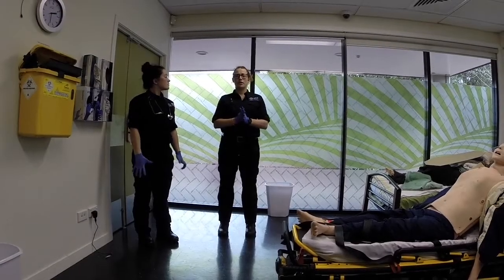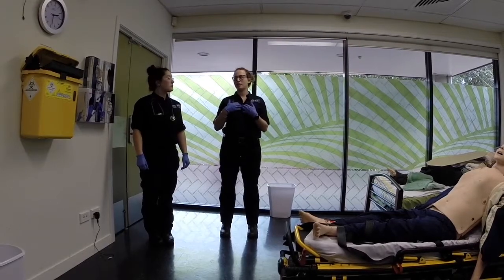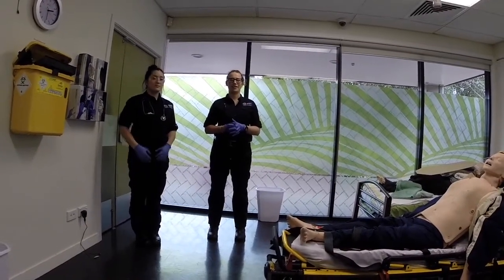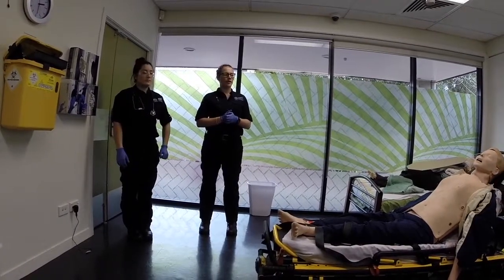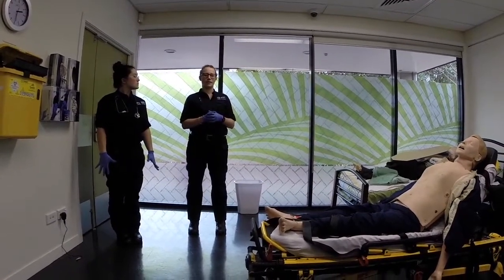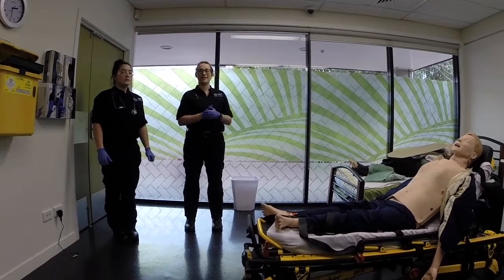So the purpose of this video is to show synchronized cardioversion, and I'll be an ILS officer and my offsider will be an EMT. So what have we been called to today? A 70-year-old male for chest pain and collapse. Okay. So on the way to this job, obviously we want to consider safety, so we'll use the setup mnemonic. However, for the purpose of this assessment, we would just be saying that the scene is safe.